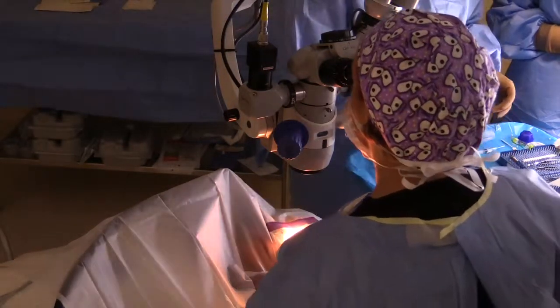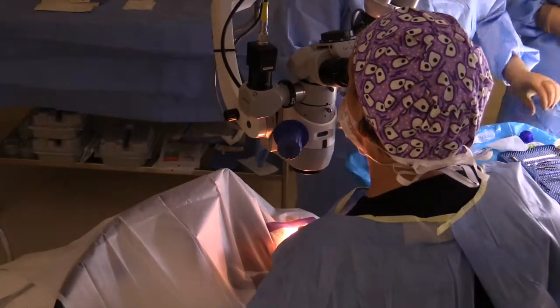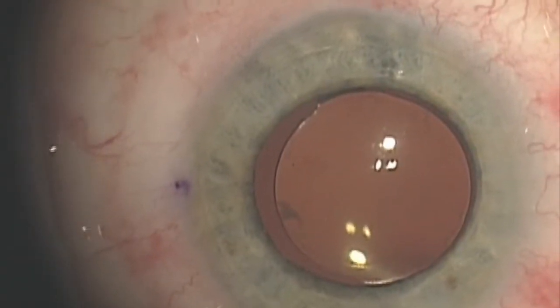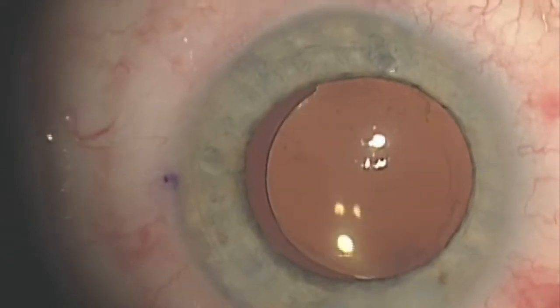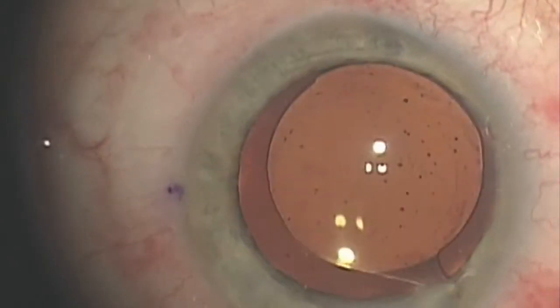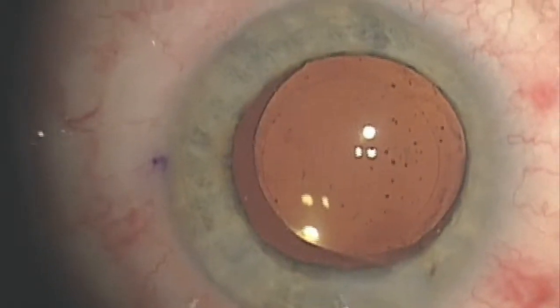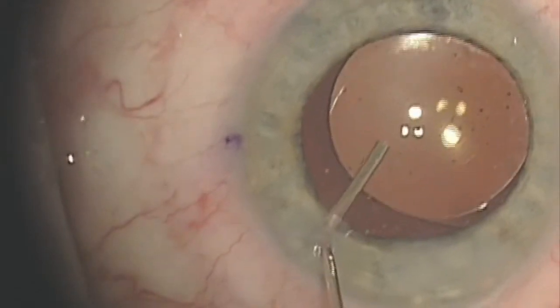Okay, now this is basically the home stretch of the procedure. Because what we're going to do is get the eye pressure back to where it should be. Look at the light for me, darling. There you go. Okay, perfect. Now we're going to hydrate the surface of this ring here. The top, we hydrate this incision from the laser a little differently than we do our typical incision.